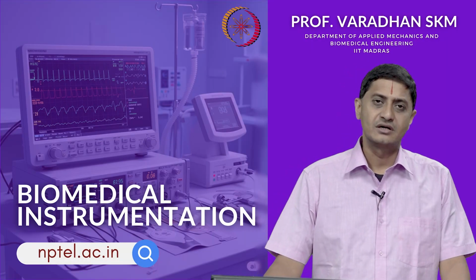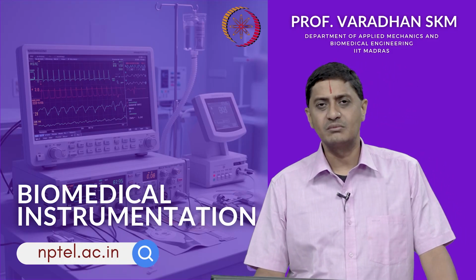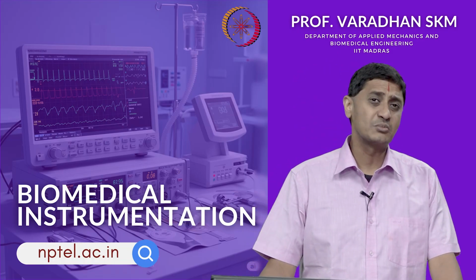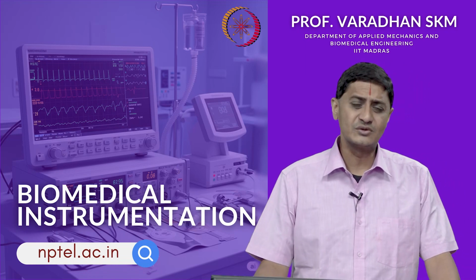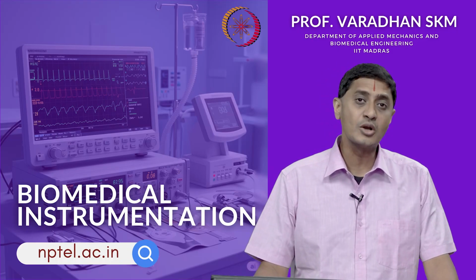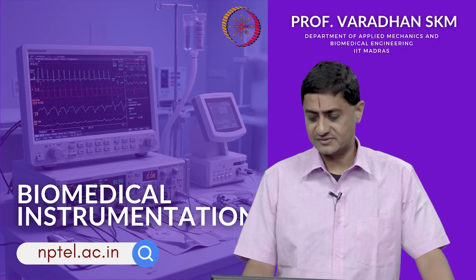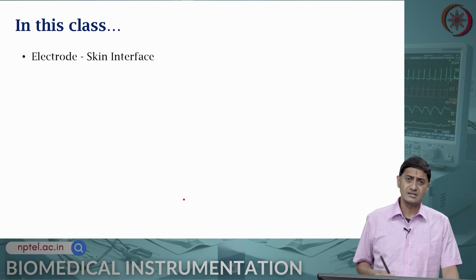Welcome to this course on biomedical instrumentation. We have been looking at biopotential electrodes. In the previous set of videos, we looked at electrode characteristics, polarizable and non-polarizable electrodes. And in particular, in the last video, we looked at an example of a nearly perfectly non-polarizable electrode, perhaps best suited for biopotential recording applications, which is the silver chloride electrode, which happens to be a stable recording solution.